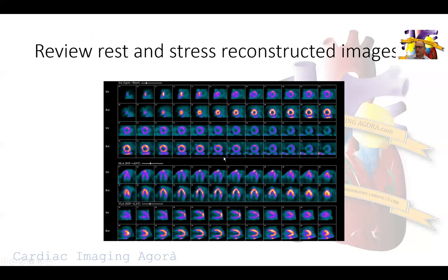When we process the images, this is what we found on the rest images - in the bottom row you can see a complete donut or bagel, full circle, no perfusion defects from apex to base. Very minimal, if anything, perfusion defect at the base in the inferior wall, very consistent with diaphragmatic attenuation.